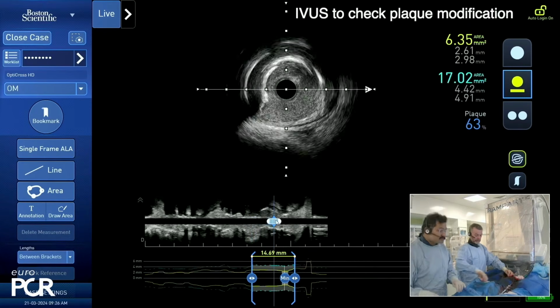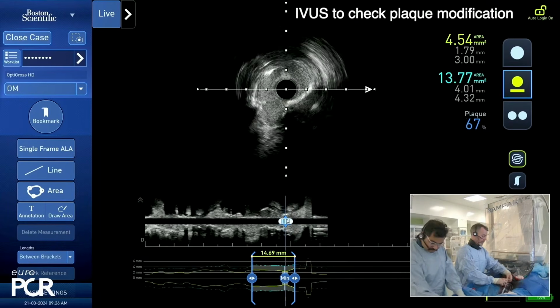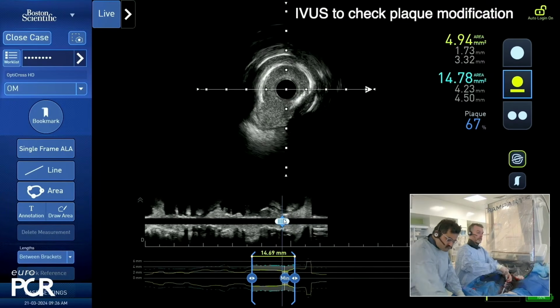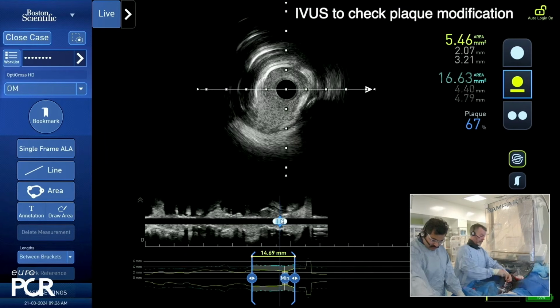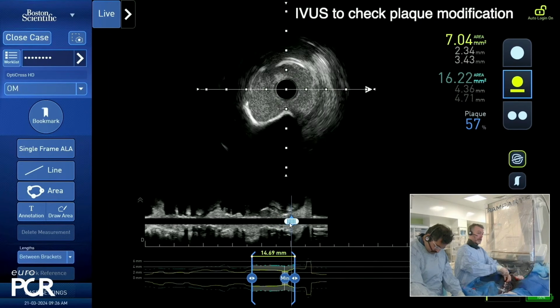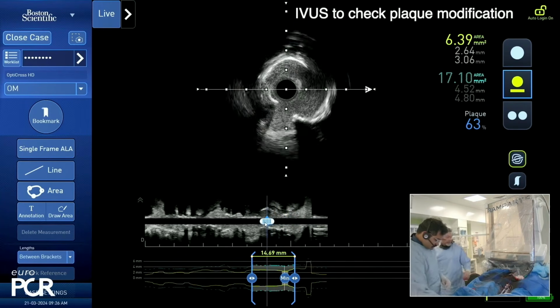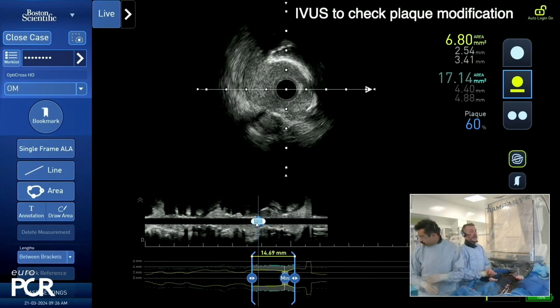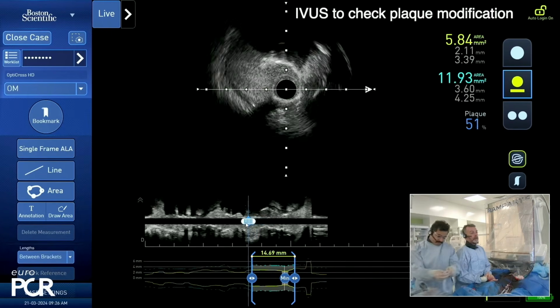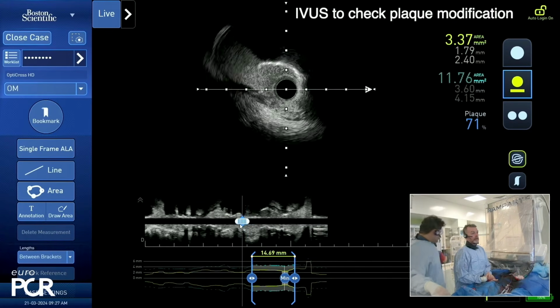Let's have a look at the lesions. So this bit where it was really tight before, certainly it's 2.5 by 15 or 20 NC, please, with quite a lot of reverberation around here and here. Is that the proximal lesion? Yeah, that's a proximal lesion. So I guess what we're looking at then is degree of recoil, isn't it? That the balloon was up, fully expanded, and your implants required to prevent the recoil. That's fracture. What length is this? 15.